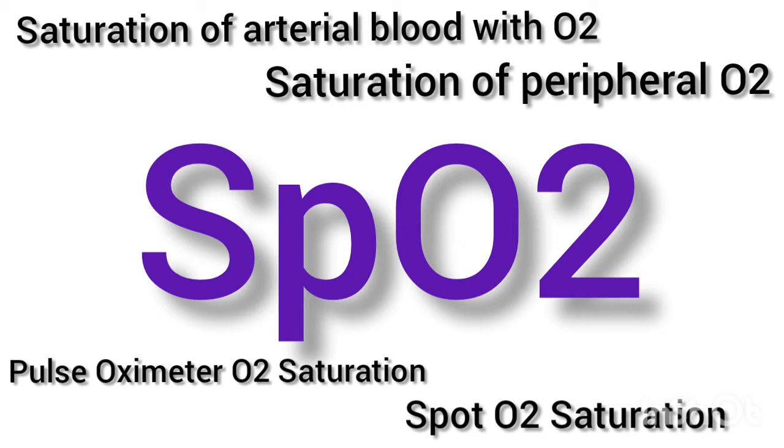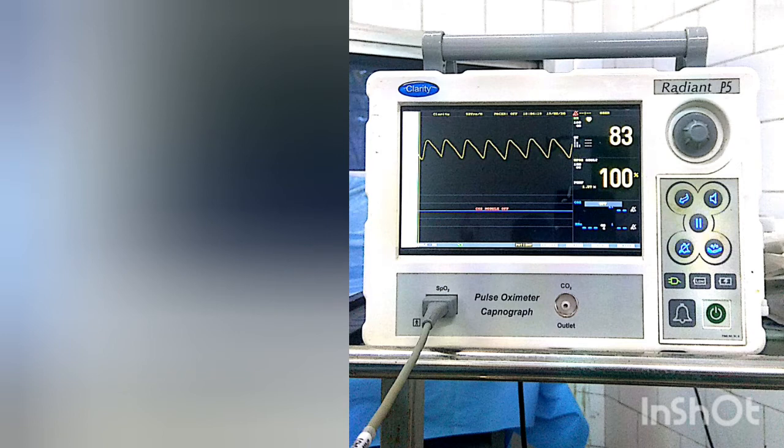Sometimes doctors would ask the nursing staff, how much is the SpO2? Or what is the oxygen saturation? Or even simply, what is the saturation? Or how much is the saturation? They all mean the same. The answer would be 98% or 95% or 80% as the case may be.